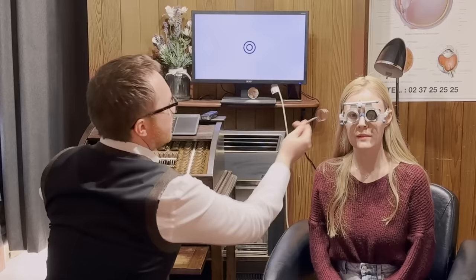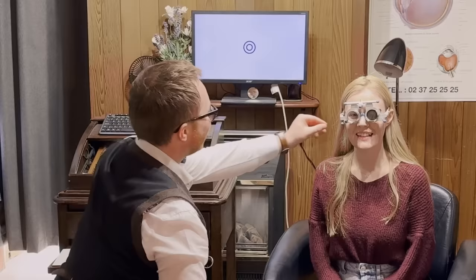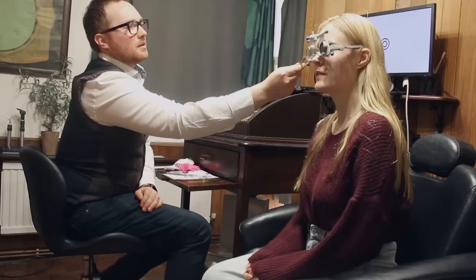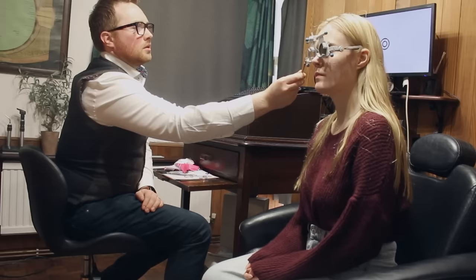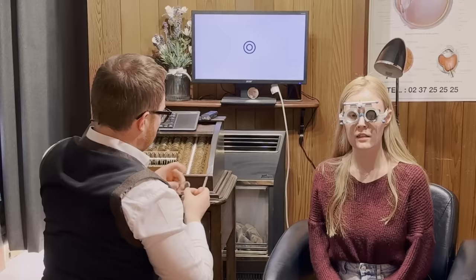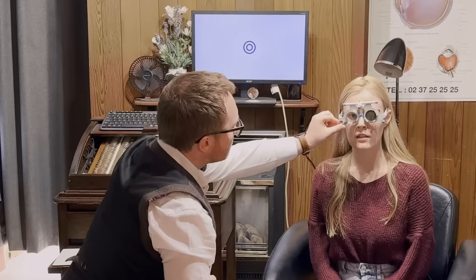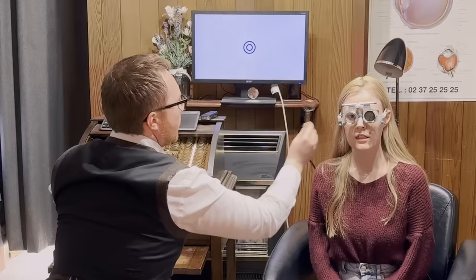And number one or number two? One, two, or not much difference? Not much difference. That's okay, don't worry. And number one, number two are about the same. One, two. One. That's good. And then number one or number two? Two. Two's a bit better. Yeah. That's good. Number one, number two are about the same. One, two. One. Perfect.